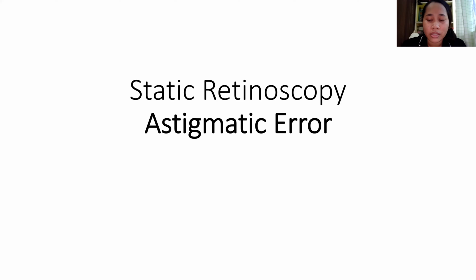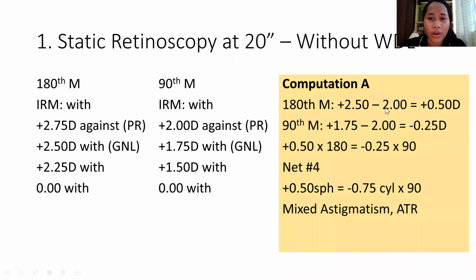So I'll just discuss the case problem that we have in our module. This is case number 1 without WDL. So on the 180th meridian, the IRM is with.